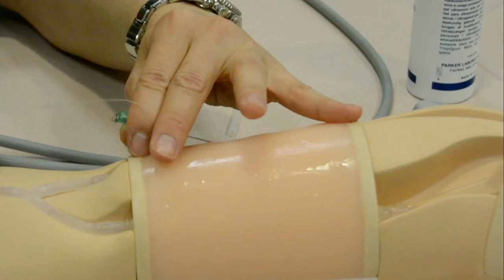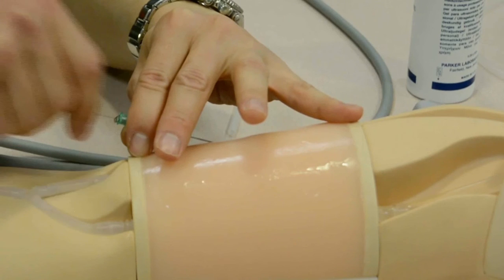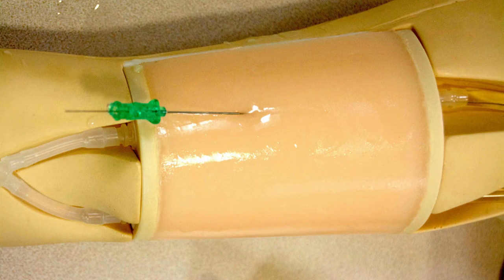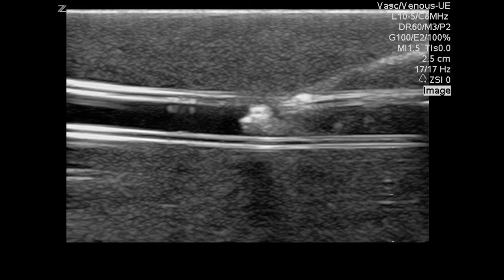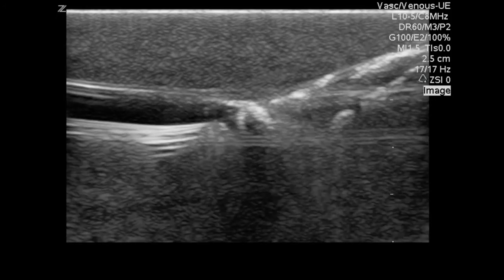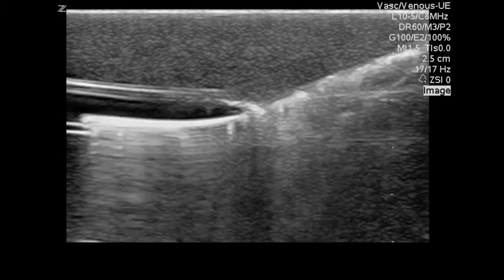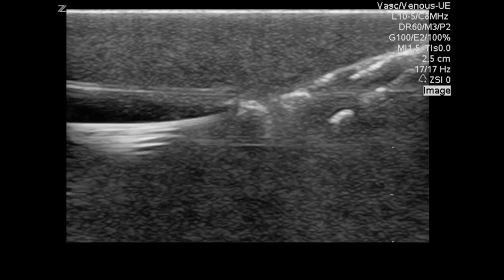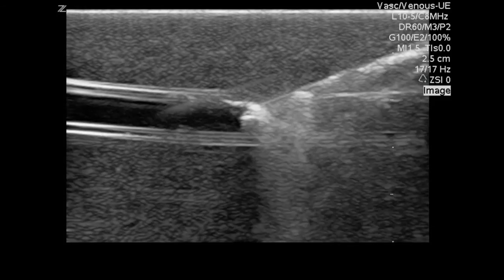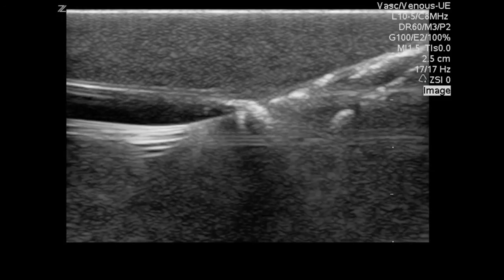Once we have confirmed access and cannulation, we advance a soft tip straight wire through the needle into the vessel. This would be a micropuncture wire — a much smaller wire — and then normally you would dilate up to a larger wire. You'll have the needle in place with the wire through it, and you can see the wire exiting at the proximal portion of the insert into the blood vessel. It's important to note this is a straight tip wire and not a J-tip wire. A J-tip wire could cause problems because it may get caught on some of the insert articulations.